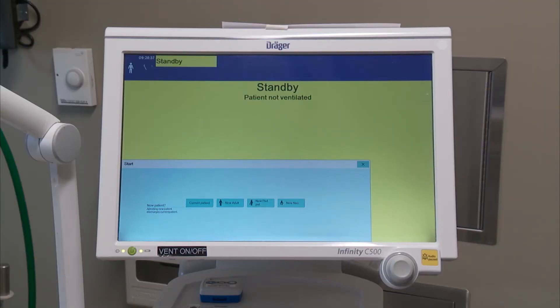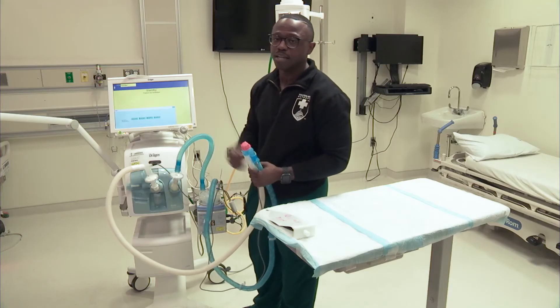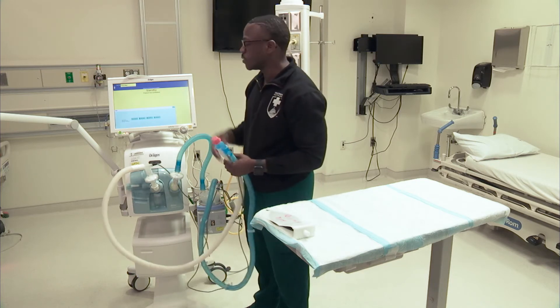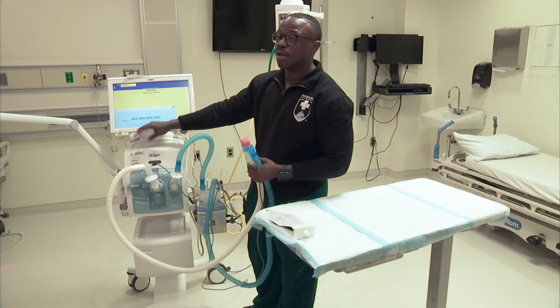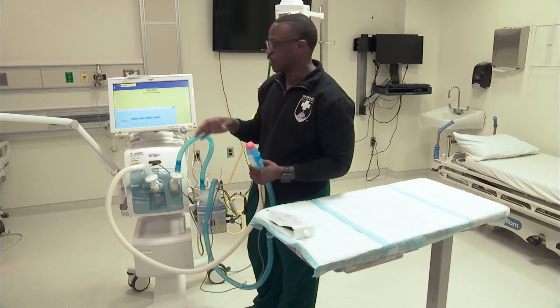When you turn the machine on, it's going to take you to this first tab. Inside that first tab, you have your current patient — that's if you need to put the ventilator on standby, bag the patient, transport them, extubate them, and put them on something else. When the ventilator is on standby, if you turn it back on and hit current patient, it's going to have all of those parameters that you set for that patient.